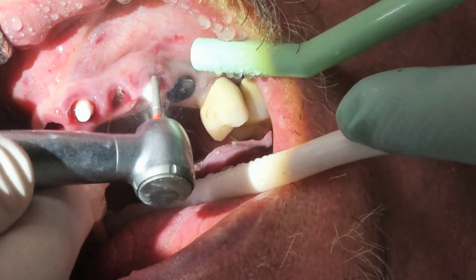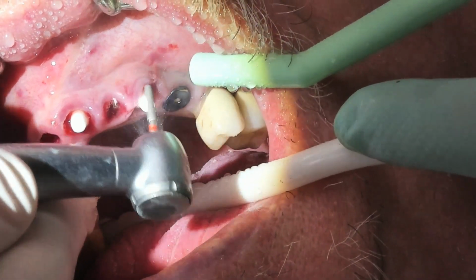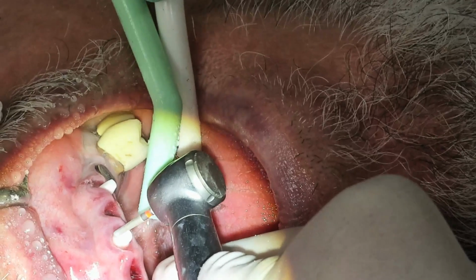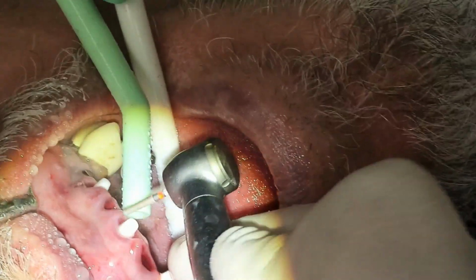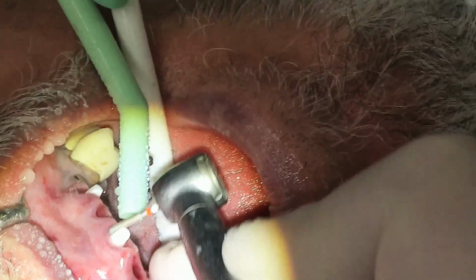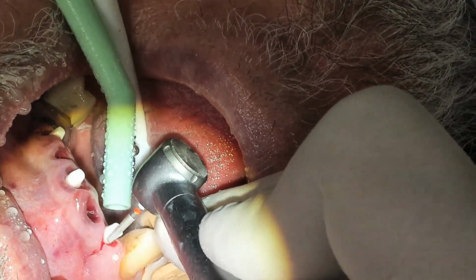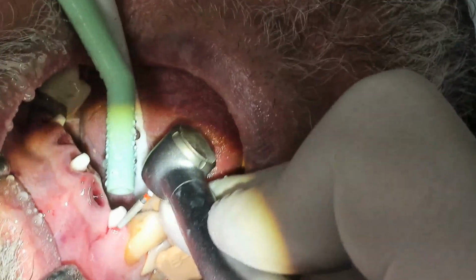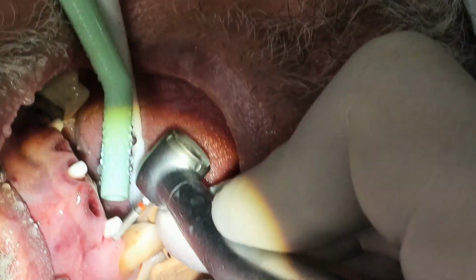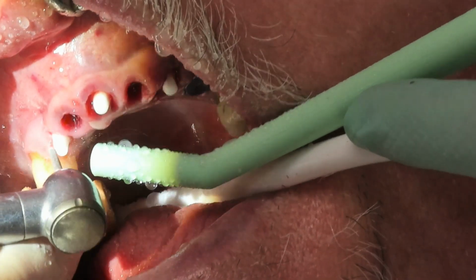But early on, I made the decision, that especially in the aesthetic zone, all implants are zirconia. And there's a lot of benefits to zirconia. Less plaque accumulation. Virtually no plaque accumulation. Translucency with the tissue. Safe biomaterial. No corrosion of the titanium. Less incidence of peri-implant disease.